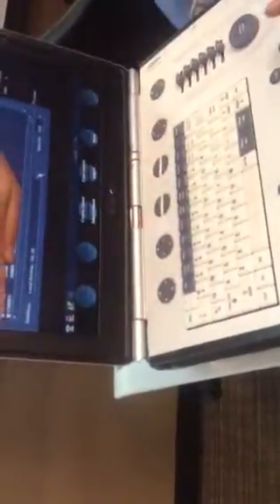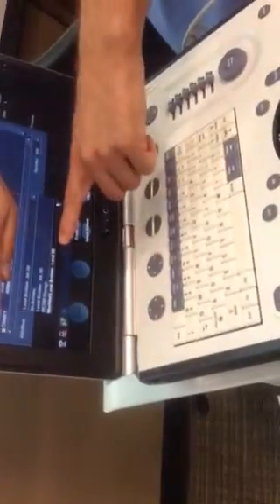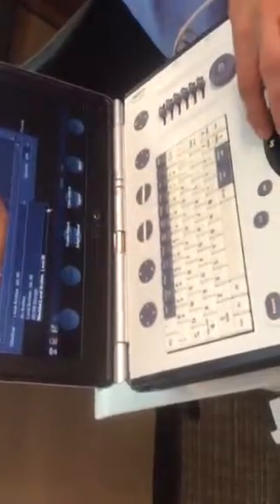Okay. So the data flow here allows us to pull up patients from Epic. I'm going to go down to work list here and click on that with the set button.